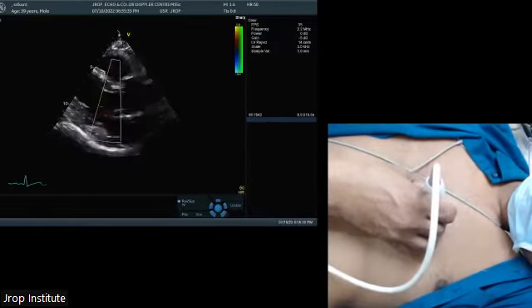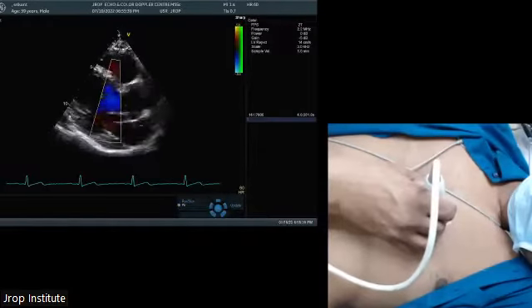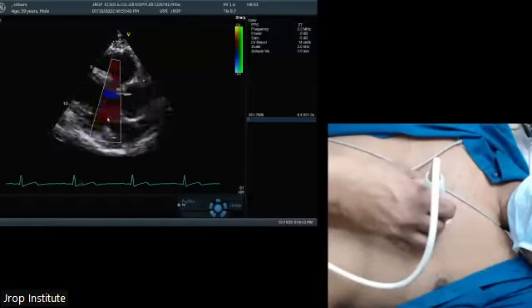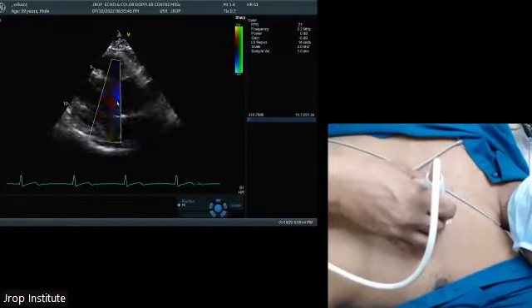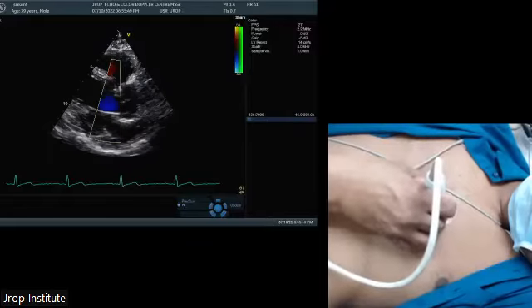Suppose I'm looking at mitral, I'm oblique, almost 90 degree. This is mitral. The flow is from this direction to this direction, but I'm interrogating in this direction. Same is aorta. So I'm not going to interrogate aorta over here. Correct?